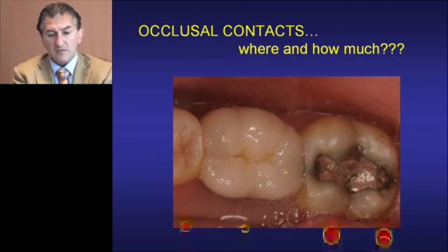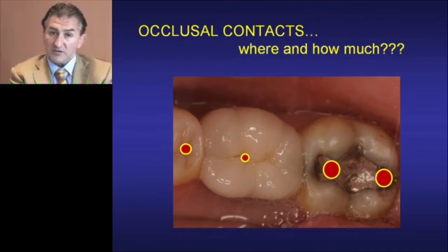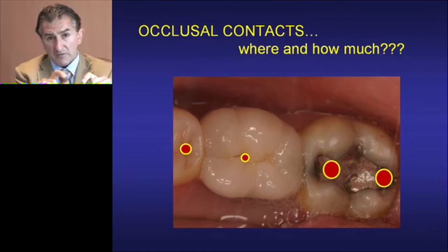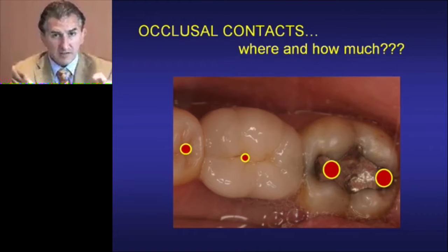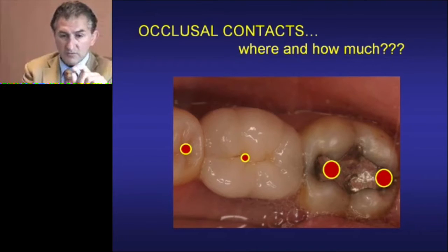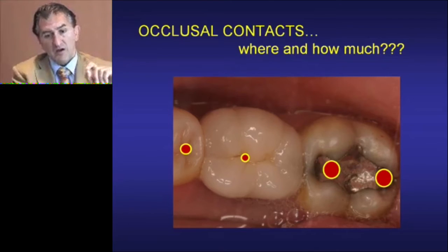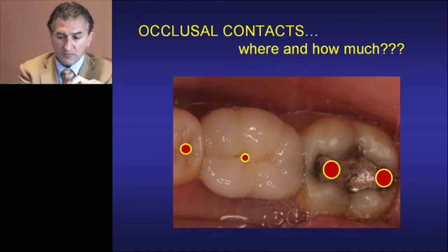So by looking at the occlusal markings, we can see that the posterior tooth has the most contact because it is the most posterior determinant of the mouth. And then we use occlusal paper that's 9 microns, the artist foil, 20 microns, the red Accufilm, or 80 microns on the blue articulating paper. Now with that, we can sort of start gauging our light contact, and we will use our 20 micron paper to just slip through of the first molar implant restoration. And our artist foil, our 9 microns, is holding on the most posterior tooth.